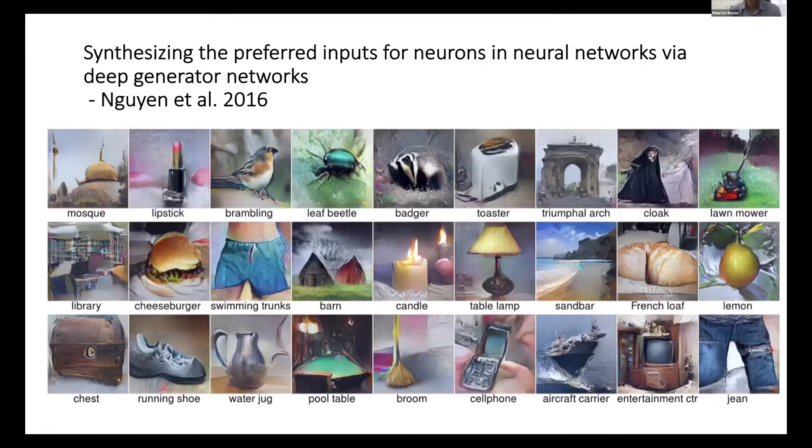Now, in medicine, these techniques have not been applied yet. As I mentioned, the area of interpretability for medical images is around 2-3 years old. And therefore, many of these techniques are now being tested to describe, for example, a typical lesion, what the system is understanding when we say this is a multiple sclerosis lesion. I would like to have an example of that from the network. And you can see here the results on different natural images.